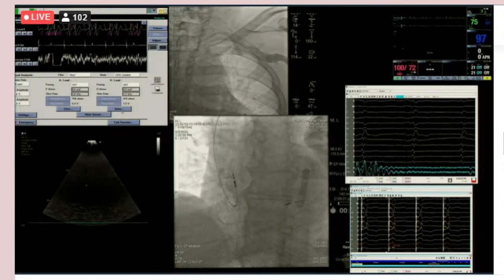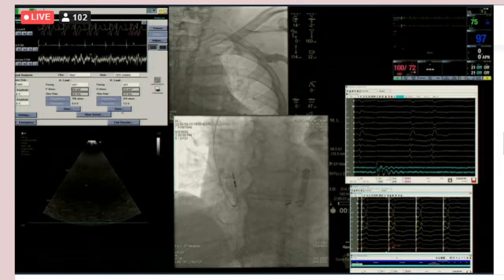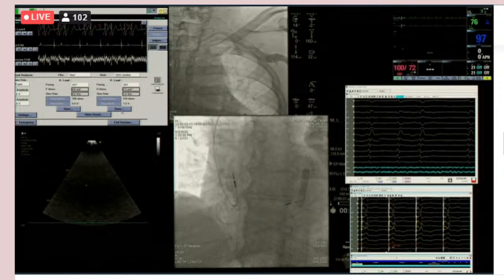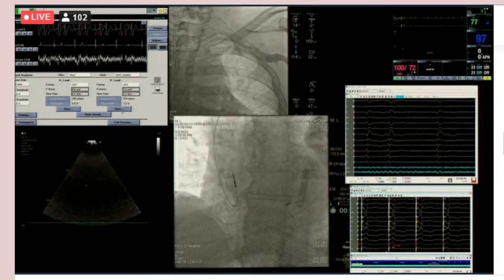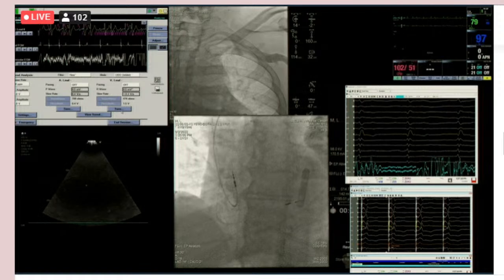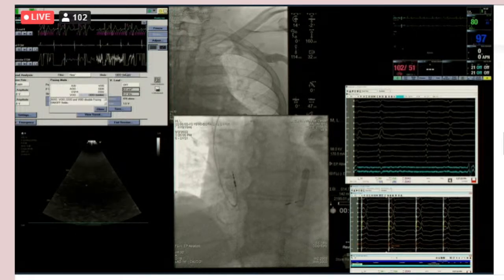Can we get a final QRS measurement from the stim? That's the other question. We always like to measure inside, but this is clearly non-selective. But usually these are still like 130. So it's rare to see these totally narrow with left bundle area pacing. Any chance we can still get a final? And the other thing is we don't know if selective or non-selective is better. Yep. And in general, it probably doesn't matter because you're still going down quick on the left side in the LV.